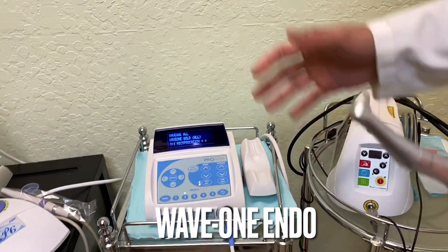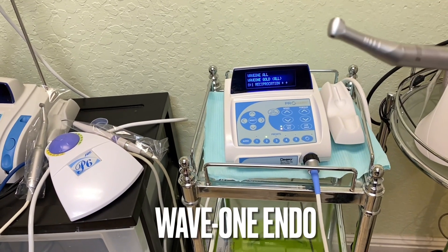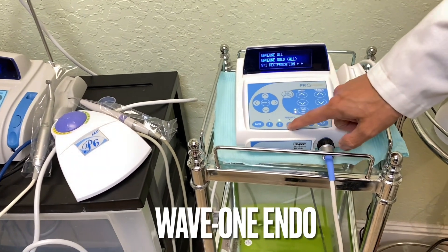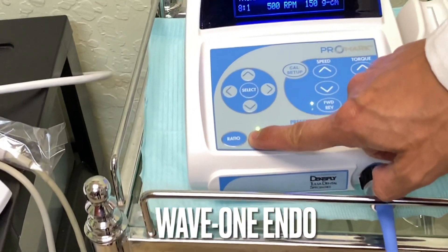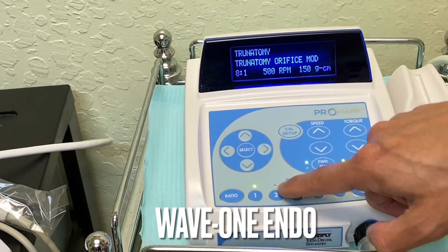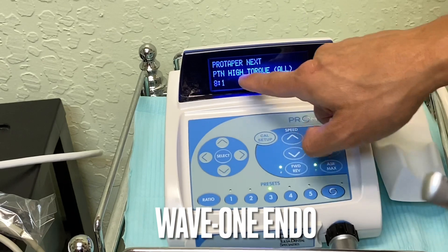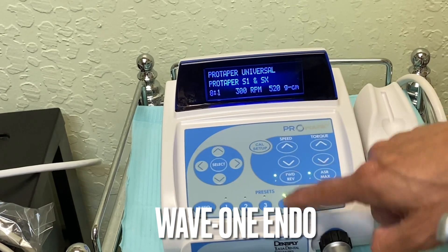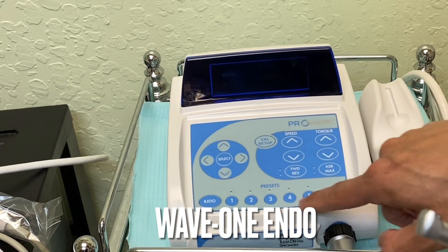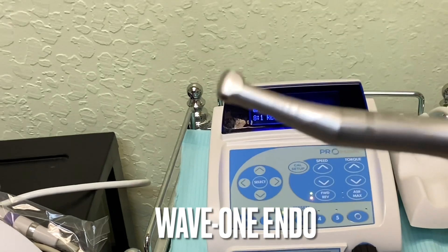Wave One is something special. I've been using different other systems like Pro Taper — they even have programming for Pro Taper, things like TF Adaptive, Pro Taper Wave One preset, Pro Taper Universal, Vortex, and different sets. But the Wave One is amazing.